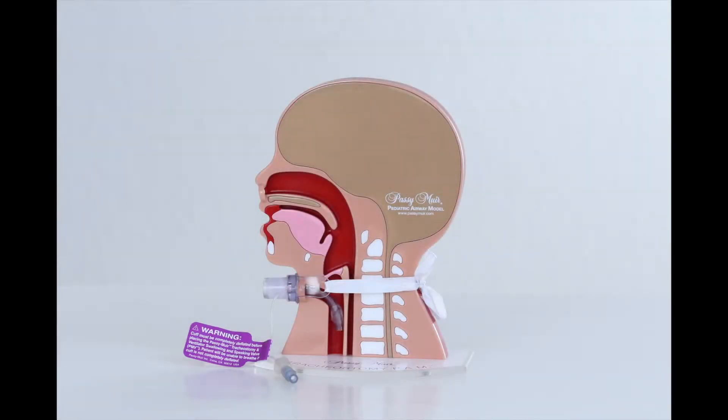Cuff deflation should be done slowly following oral care, oral suctioning, and tracheal suctioning as needed. Without airflow through the oropharynx, sensation may be reduced and secretions may have accumulated to the top of the tracheostomy tube cuff, making it difficult for patients to adjust to a deflated cuff.